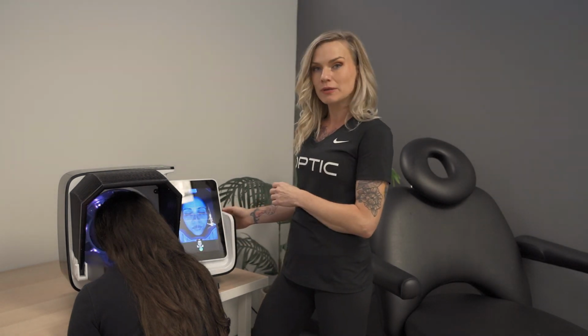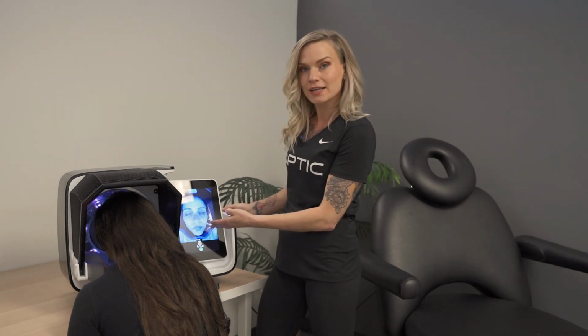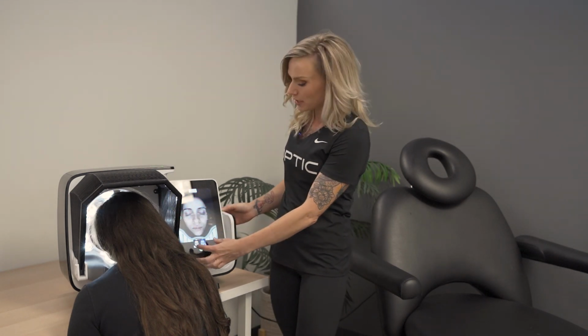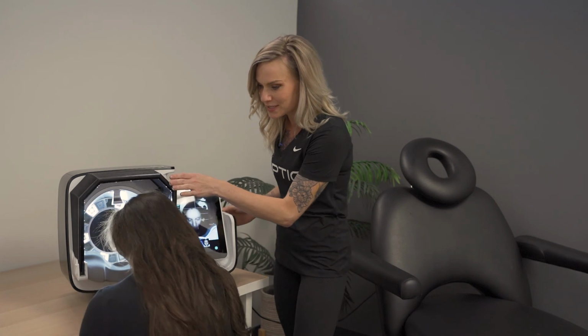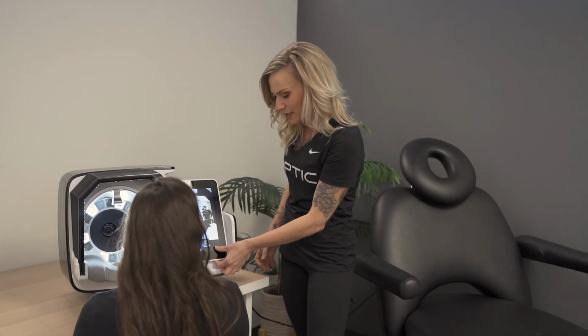That stands for red, green, blue. That's a high definition photo. Next, we have her UV lighting. That's ultraviolet. Lastly, we have PL. That stands for cross-polarized. All 3 images will populate on the bottom here. As soon as you see that 3rd photo, we can let our patient know it's okay to remove your face from the scanner. Thank you. And from here, we're gonna hit this green arrow.